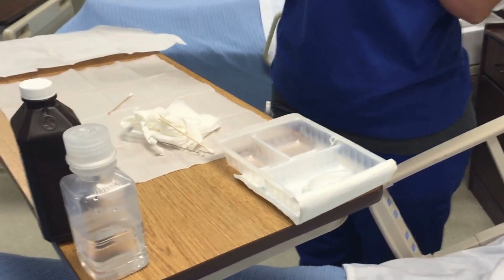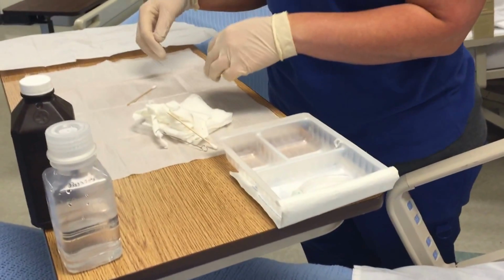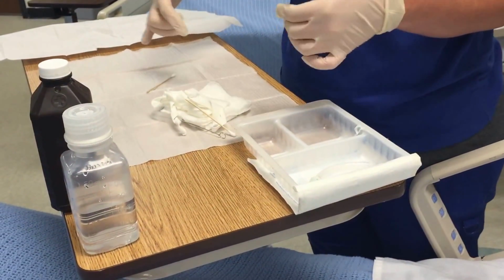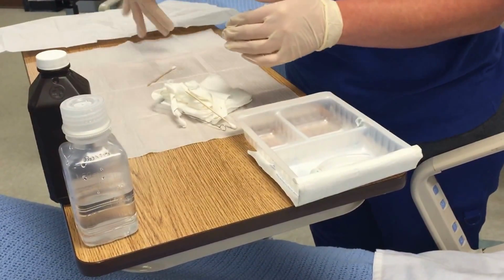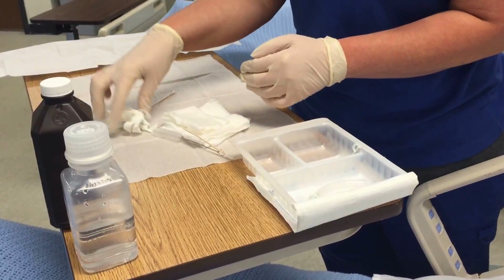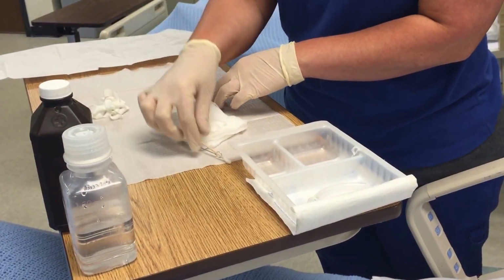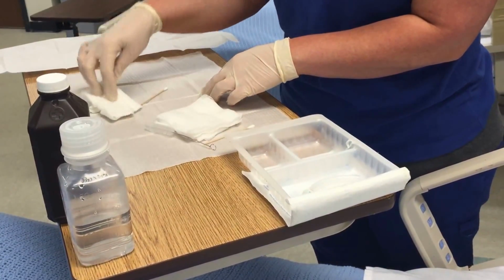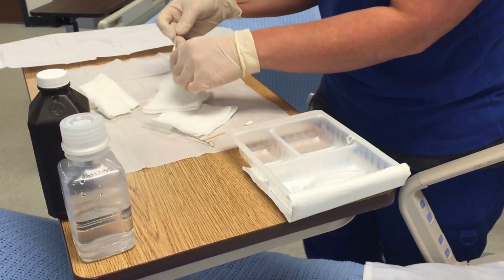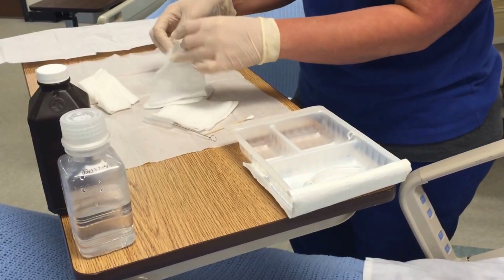And then I'm just going to leave that there because I don't want to take a risk of contaminating anything. So I want to set this up to where when I get ready to clean this trach, I don't have to worry about cross-contaminating anything in this field. So this is one of the last things I'm going to use. So I'm just going to put this right there.